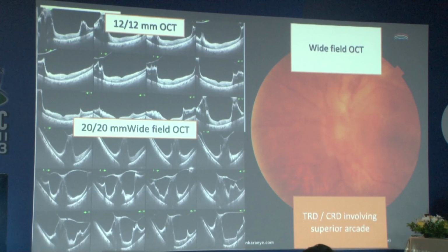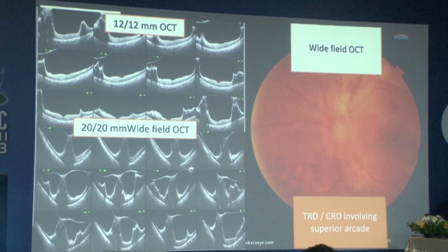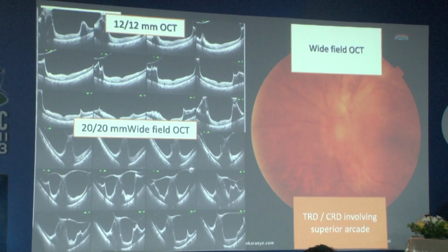But when you say PVD is there or hyaloid, there's no PVD in this. There's just the posterior hyaloid separation. That too, when you go and actually do these cases with triamcinolone, invariably there is vitreoschisis. There will be another membrane. I don't know if you are showing the video here, but invariably there will be a layer on top. So as the panelists are suggesting, these cases are not easy, and have to be dealt with utmost caution.